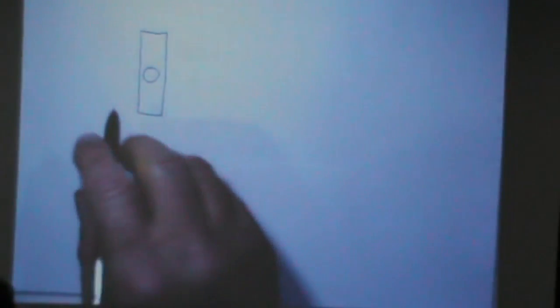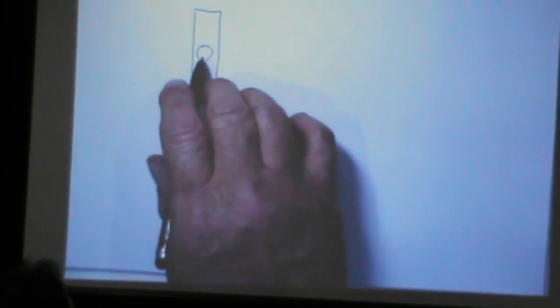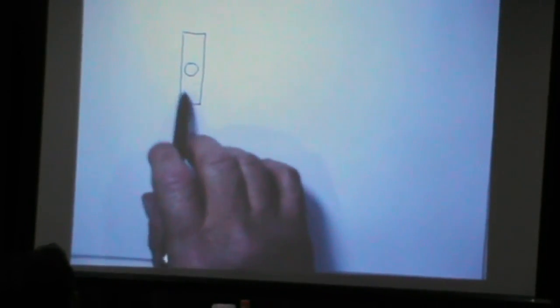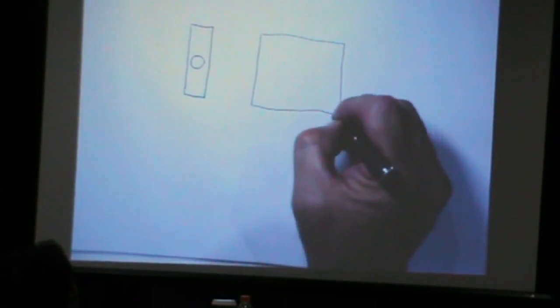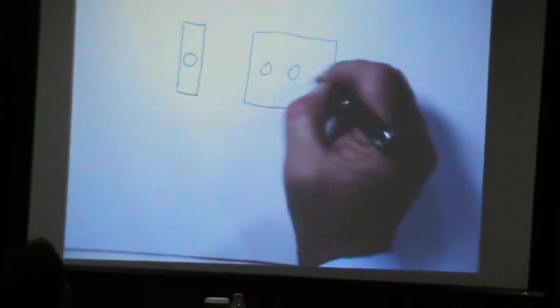Normally a BI has one disc of stainless steel. This is the package of this BI. There are some other BIs with a larger package, in the same BI holding 3 discs that are separated.